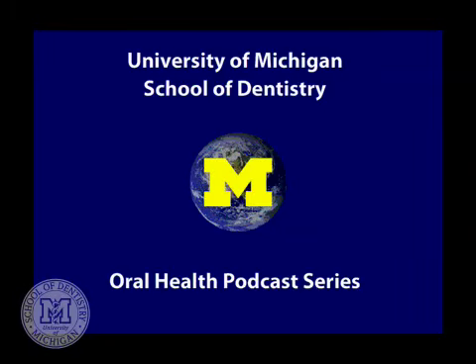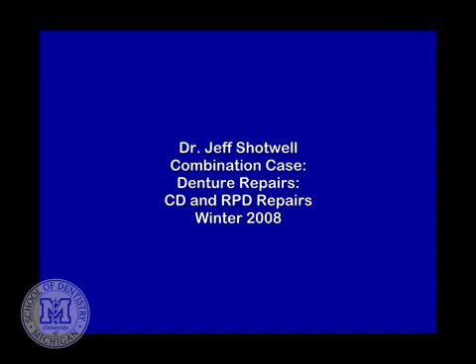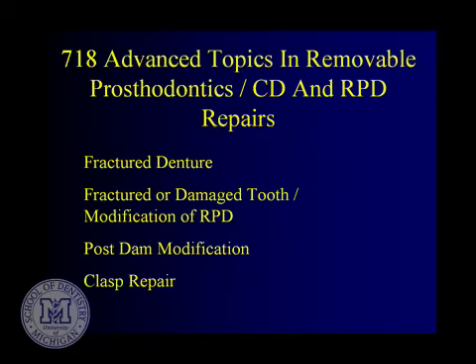Welcome to the University of Michigan Dentistry Podcast Series, promoting oral health care worldwide. Today we want to look at repairs: what do we do with a fractured denture, a fractured or damaged tooth, and we'll go through modification of a temporary partial denture, partial post dam modification, and clasp repair.